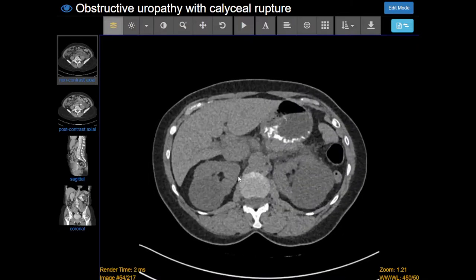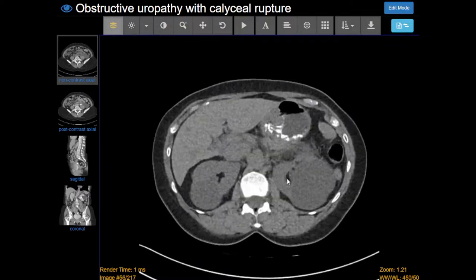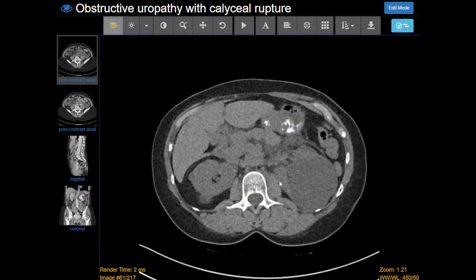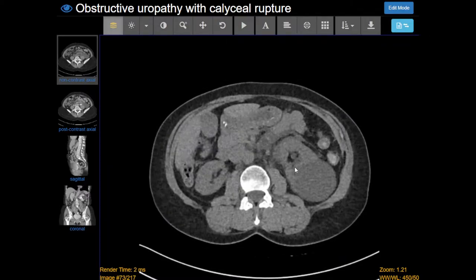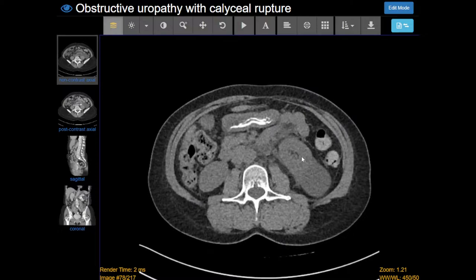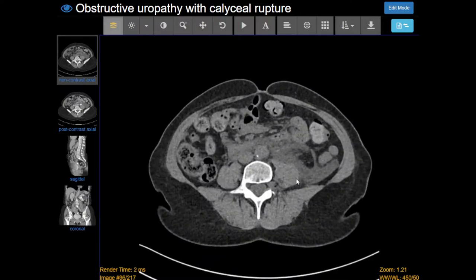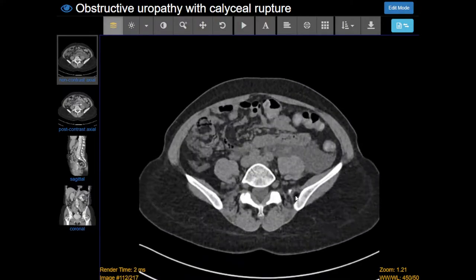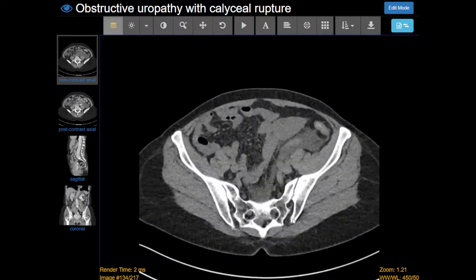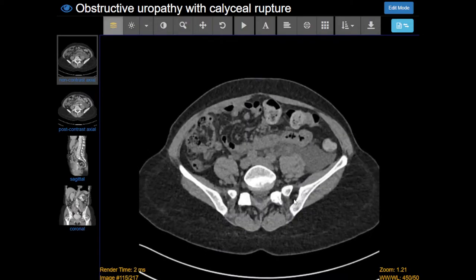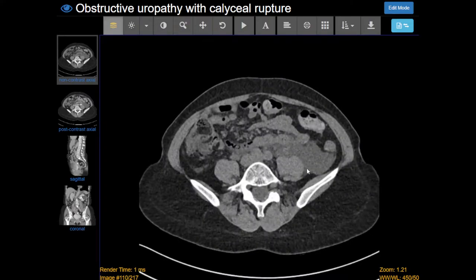We're starting at the level of the kidneys. We have some renal cysts — in this case, we're just going to ignore them. I don't see anything bright in the renal collecting systems, so we have to follow down the ureters to see if there's a stone in the ureter. Following the ureters can be difficult, especially in this case because you can see there's all this fluid in the lower left abdomen. We're going to have to figure out where that's coming from.